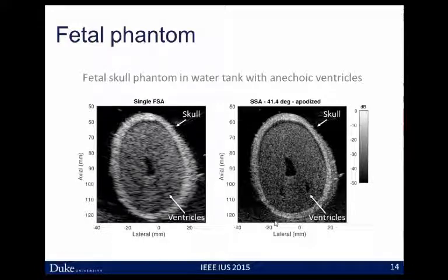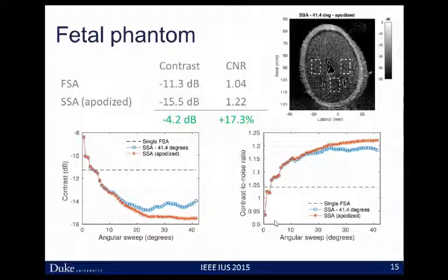We can do this with extended targets. Here we see a fetal phantom. On the left is our full synthetic aperture image; on the right, the 41.4-degree swept synthetic aperture image. We notice much better definition of the skull around the outside, a much tighter speckle pattern throughout, better edge resolution on the large interior anechoic ventricle, and we can also see two small ventricle structures that previously were on the order of the resolution cell size. We can actually see new high-resolution targets due to our sweep. We quantify improvements in those anechoic regions, seeing an improvement in contrast of 4.2 dB and an improvement in contrast-to-noise ratio of 17.3%, in addition to the qualitative resolution improvement.